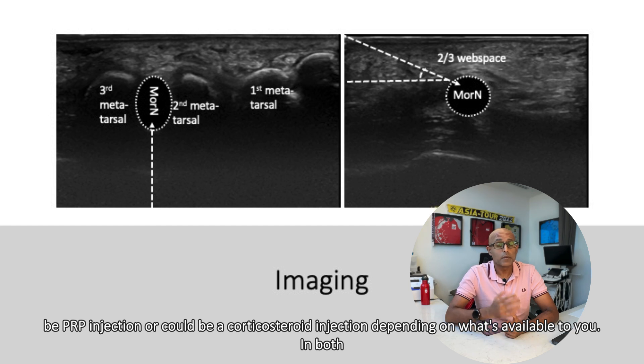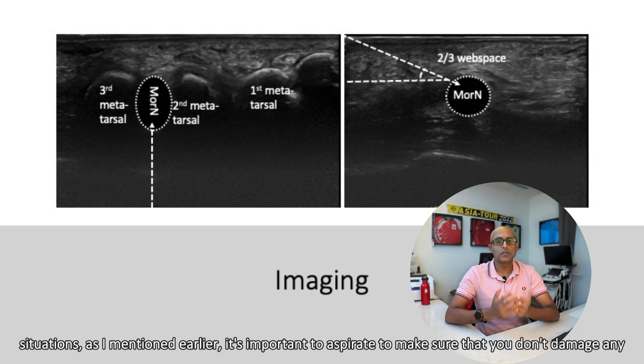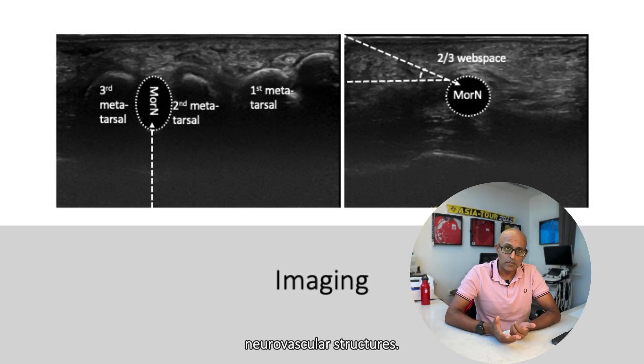The substrate could be a PRP injection or a corticosteroid injection, depending on what's available to you. In both situations, as mentioned earlier, it's important to aspirate to make sure that you don't damage any neurovascular structures.